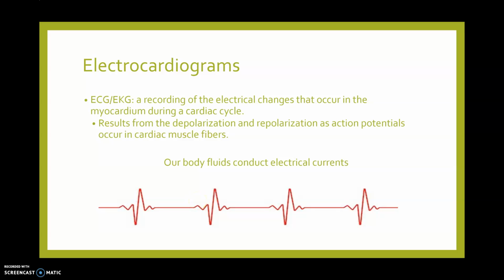Hi everyone, we're going to start today talking a little bit about how we can start to measure some of the parts of our cardiovascular system. So the first thing we're going to talk about today is electrocardiograms, or what you might know better as an EKG or an ECG.